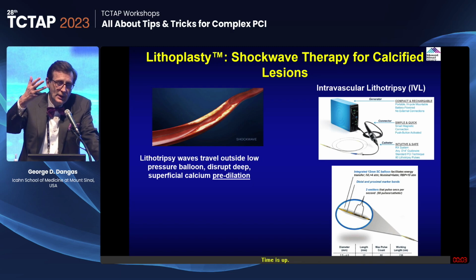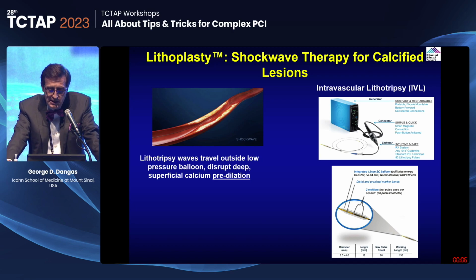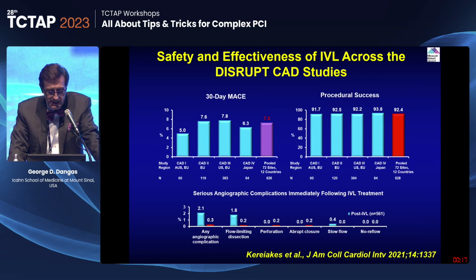So following that, you may want to perhaps take this technique up to even 3.5 or 4.0 vessel if need be. It's also available in the periphery, so the size limit is not there. So it can be particularly helpful for these larger vessels, one can say. There are different studies, but clearly small feasibility assessments, and obviously, due to being a balloon and highly familiar in how to use a balloon, it has certain safety features that are undoubtedly obvious to everyone.